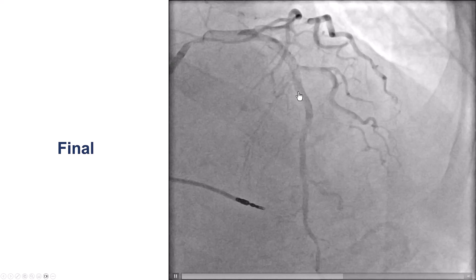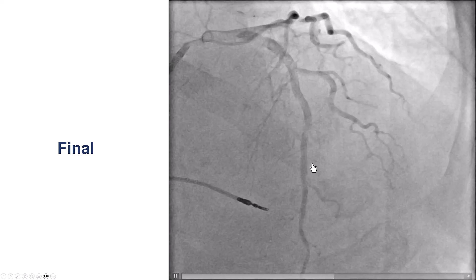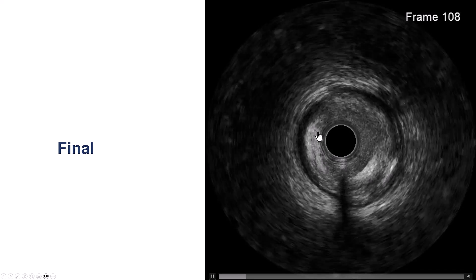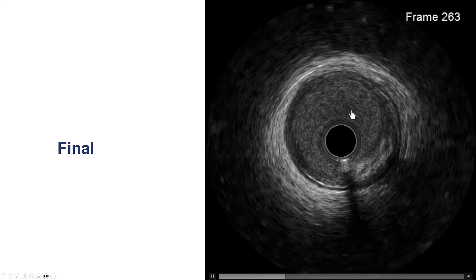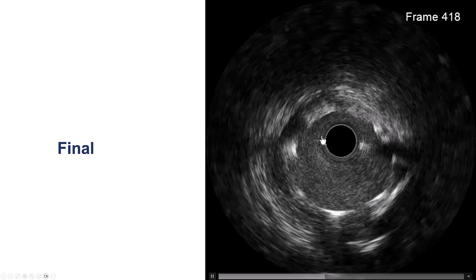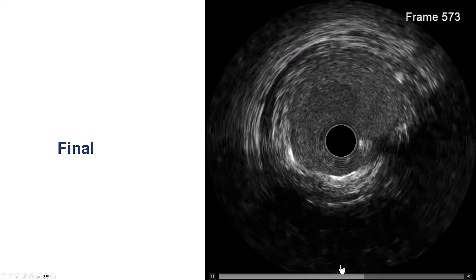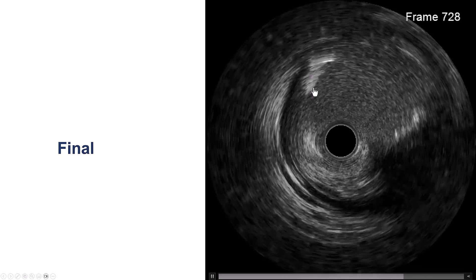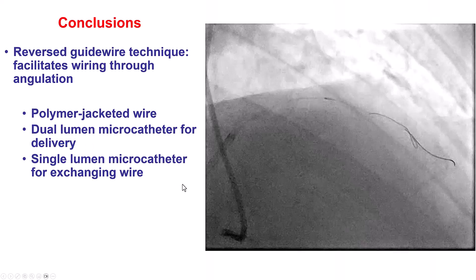This is the final result after stent implantation. There is some residual disease distal to the stent, so intravascular ultrasound was performed to confirm the result. IVUS shows some diffuse disease distally with some plaque. Pulling back further, we see the stent, which appears well-expanded and well-apposed. Coming back to the left main, overall we have a good result with no significant issues inside the stent.